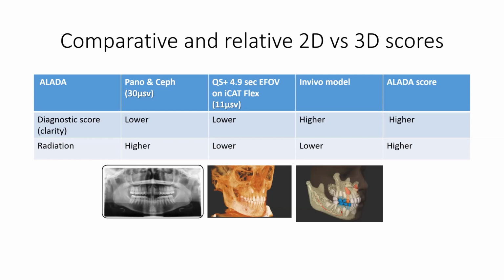What we're going to be talking about today, functional dynamic modeling, is interchangeable with many things. In vivo model is the product name that Osteoid delivers for what we're going to be talking about today. Osteoid was previously known as Anatomage, and the product used to be called Anatomodel. Now the company is Osteoid, the product is called in vivo model. I may refer to Anatomodel, I'm still getting used to it. It's in vivo model. It's also known as surface mapping or segmentation, and that will become clearer as we go.